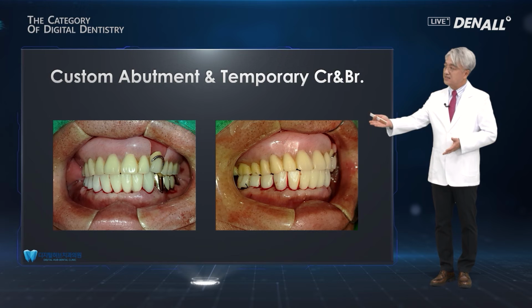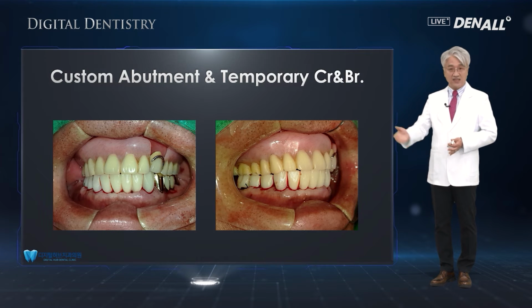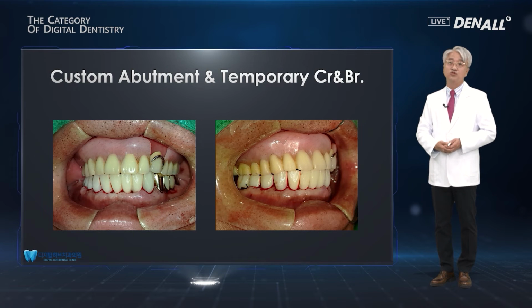So we set it up to the patient, and before we do occlusal adjustment, the margin fit, the quality, and occlusion are all good. So with digital dentistry, this type of quality is available even today.